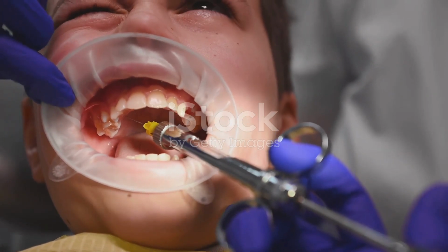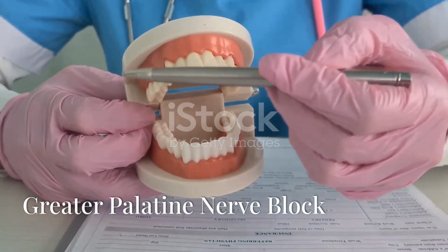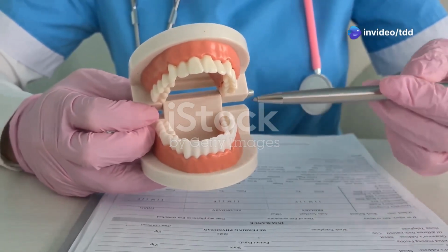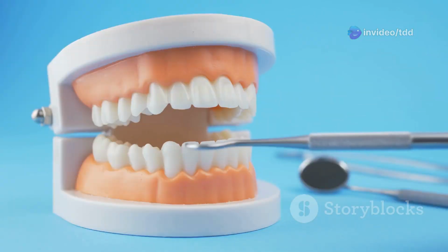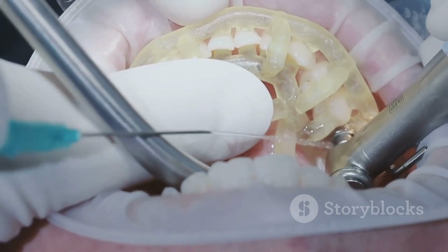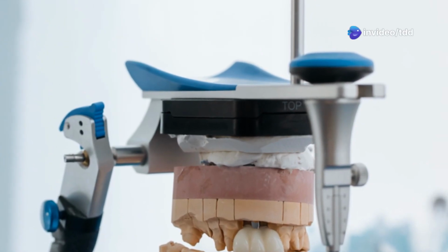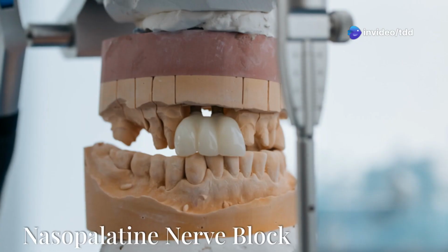For procedures involving the palatal tissues, we use these two nerve blocks. The purpose of the greater palatine nerve block is to anesthetize the posterior hard palate and soft tissues up to the first premolar. To achieve this, you should inject near the greater palatine foramen. The key landmark to look for is the palate near the second or third molar, about 1 centimeter medial to the gingival margin.